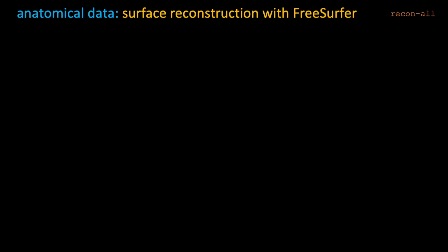Okay, so with this, I would like to talk about FreeSurfer. This is going to be a 3-slide crash course on FreeSurfer or recon-all, which is part of FreeSurfer. For people who have used it before, it's probably just going to be boring. For people who haven't heard of it, it's probably not going to be enough information. So I'm going to point to different sources where you can find more about different aspects or different subparts of this surface reconstruction.